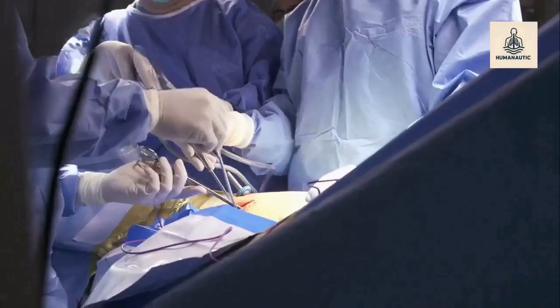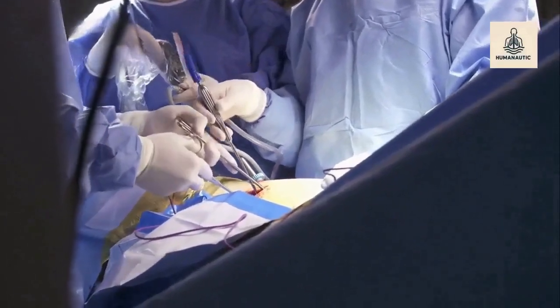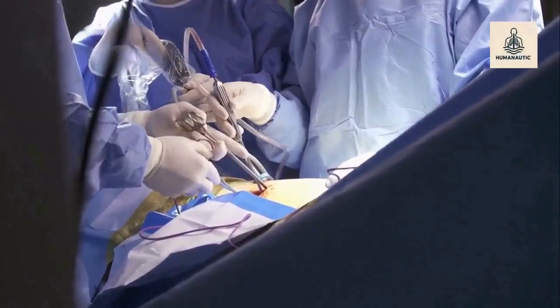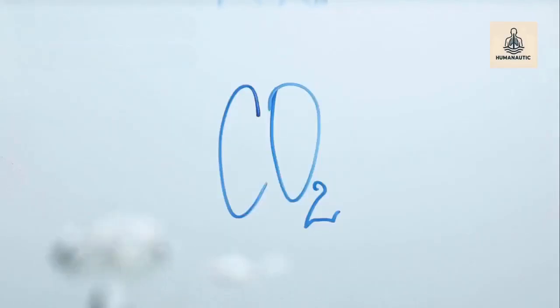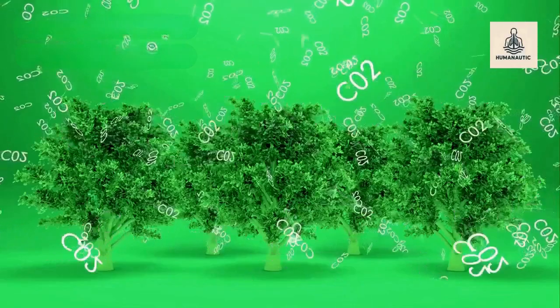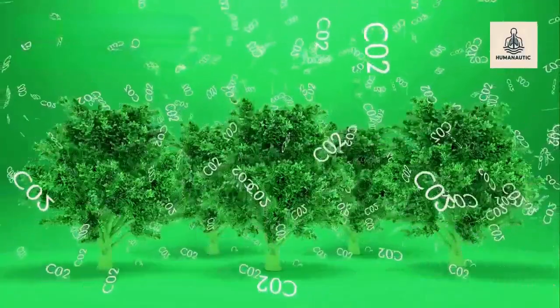Pneumoperitoneum, creating the working space. Laparoscopy begins with establishing a pneumoperitoneum, a controlled expansion of the abdominal cavity using carbon dioxide gas. Why carbon dioxide? Because it's non-flammable, rapidly absorbed, and easily cleared by the lungs.